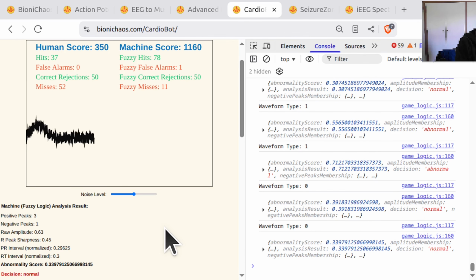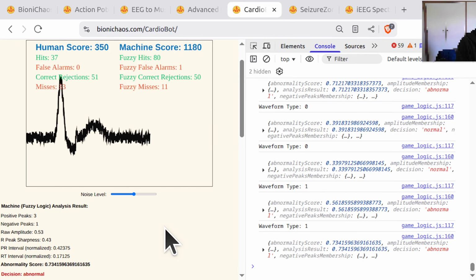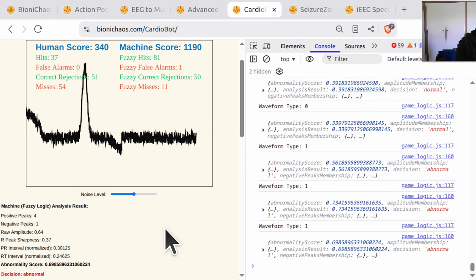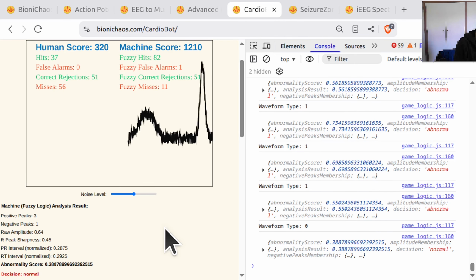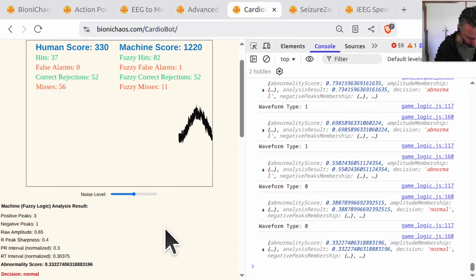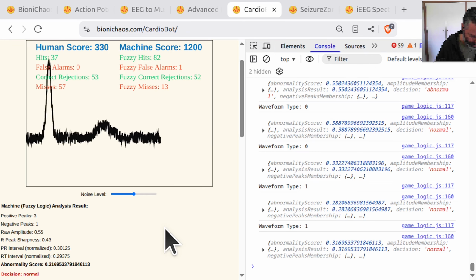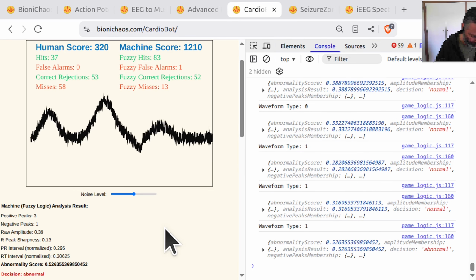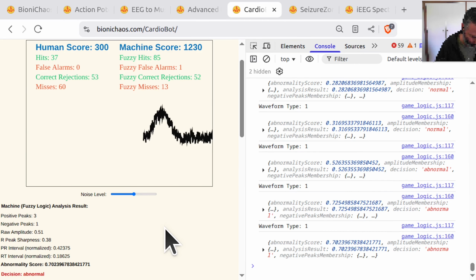And then you have the rules, right? The common sense medical knowledge baked into the code? Correct. The system uses a set of rules like if the PR interval is long or the R-peak sharpness is low, then the abnormality is likely. It aggregates the scores from all these rules, the number of peaks, the amplitude, the timing, to form a final, single abnormality score between 0 and 1.